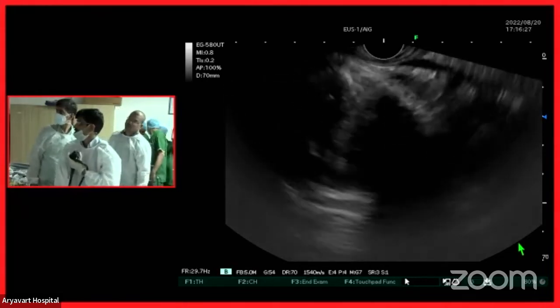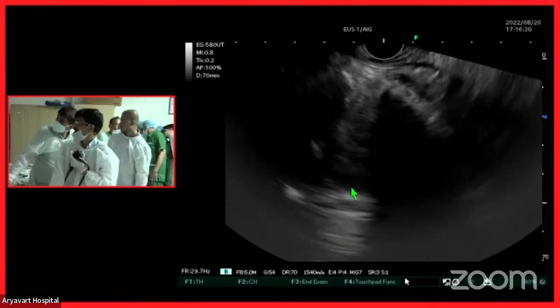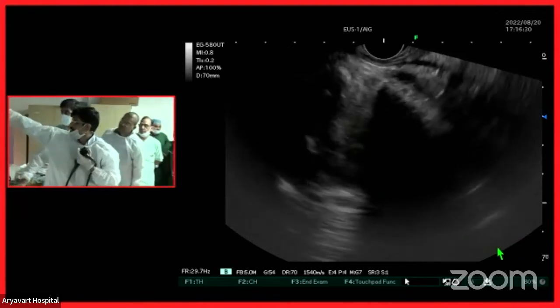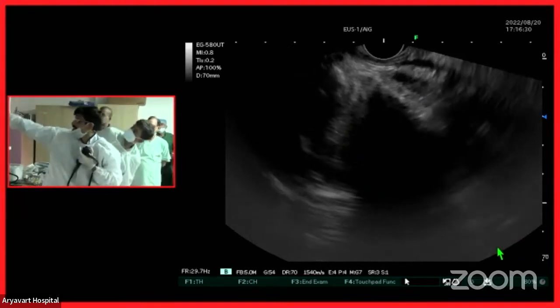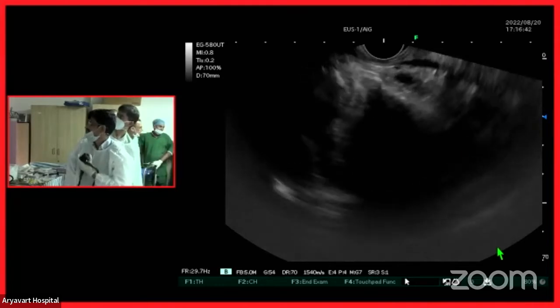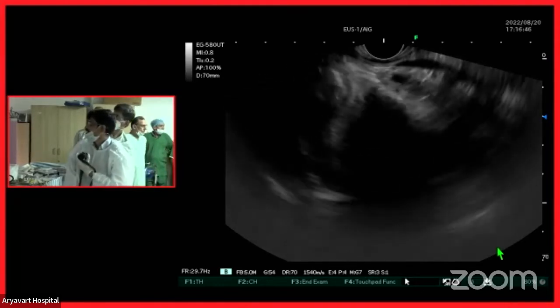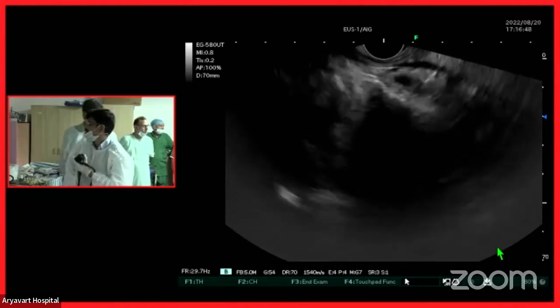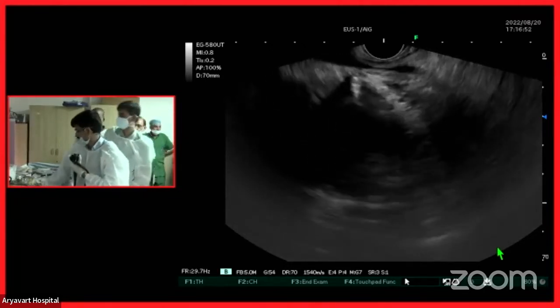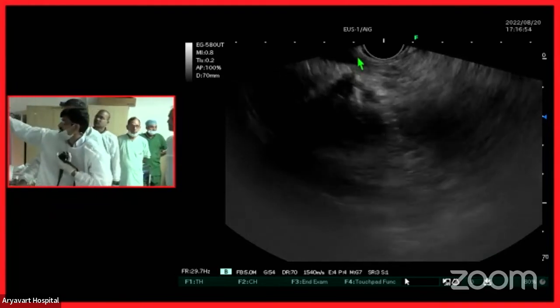I see something appearing over here, something very vaguely defined and possibly some acoustic shadowing going through there, the hyperechoic structure with an acoustic shadow going through there. Don't know if I'm reading too much into this, but that one there, do you agree, Vikram? Do you agree there's something here? Have a cursor. Yeah, this one here, this one here. Is that causing?